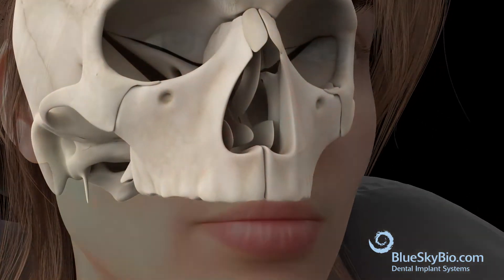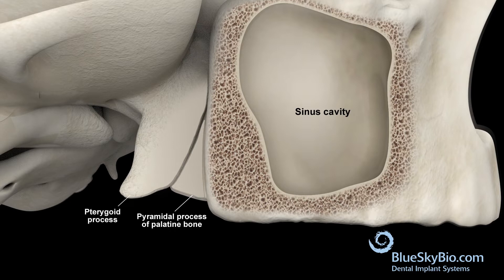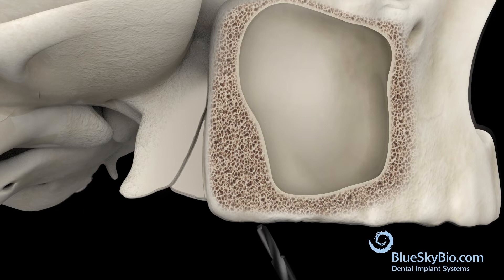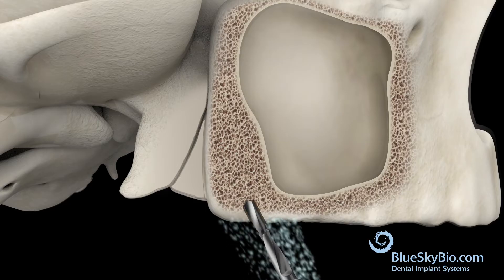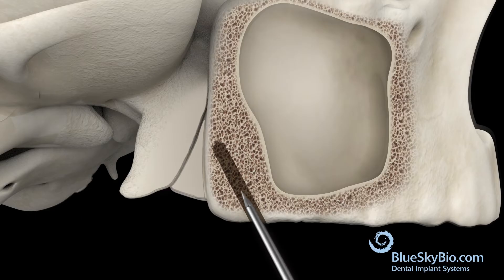Here are the three main anatomical landmarks for the pterygoid implant surgery: the sinus cavity, the pyramidal process of the palatine bone, and the pterygoid process. Start with the P1 starter drill. Once you've reached depth, an osteotome is used to reach the dense bone plate.